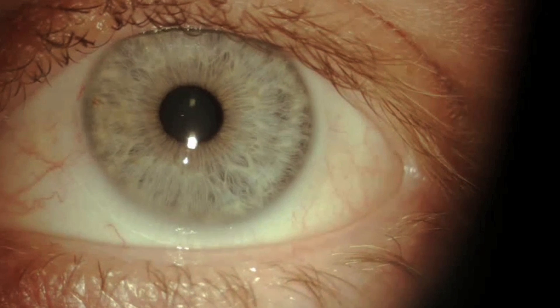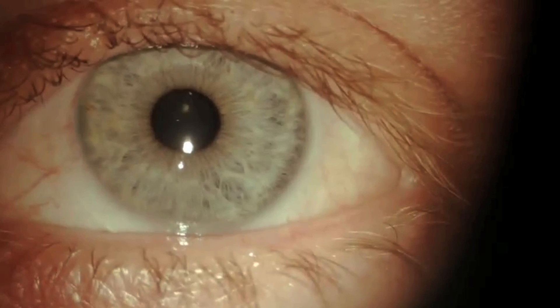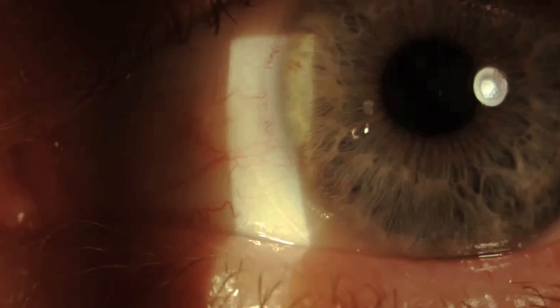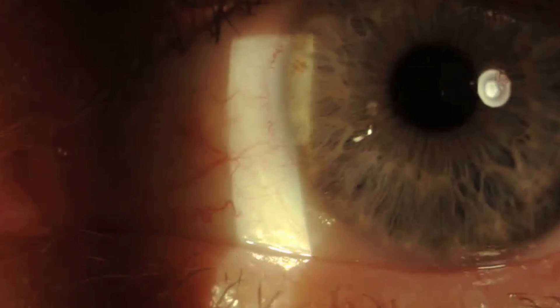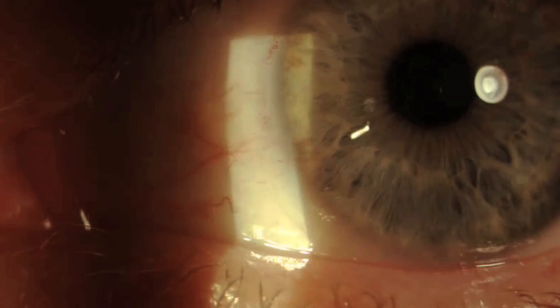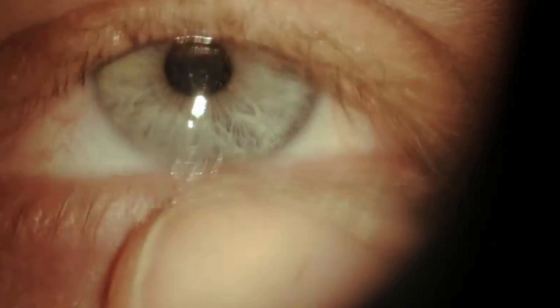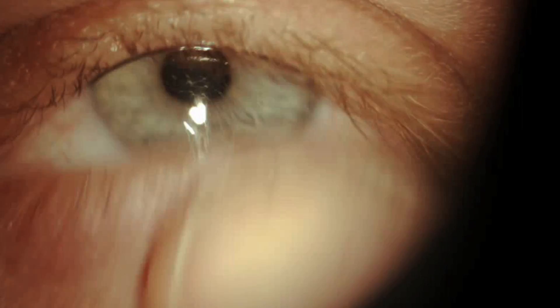Look for good centration, full coverage of the cornea, and adequate movement. Evaluate the movement with your beam inferior nasal — a soft lens should move about a half to one millimeter. One millimeter happens to be about the overlap of an average lens on an average cornea, so if the lens moves halfway up to the limbus, then your movement is half a millimeter. If you don't see adequate movement this way, then do a push-up test. Use the lid margin to push up the lens and assess whether it's a smooth and easy movement. Try not to avert the lower lid when you do this, as it'll make it more difficult to push the lens up.